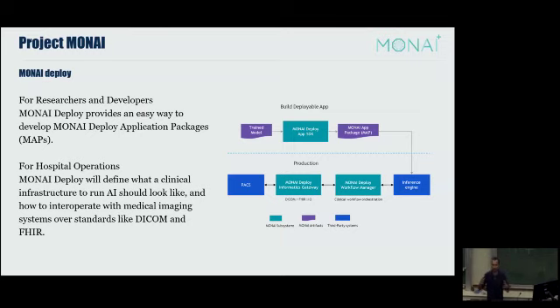Once you've got your application, we're able to, using a JSON file, but you can have other things, fully redescribe the network, the architecture, how it's been trained, and then package it so that you can make it an application and then deploy it into your environment. I will show you an example after.